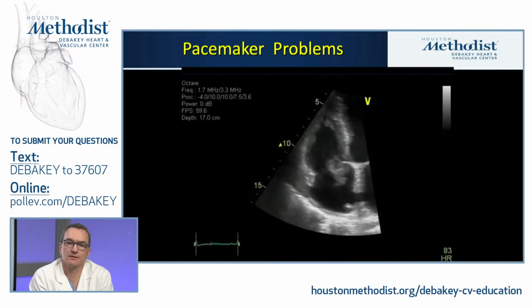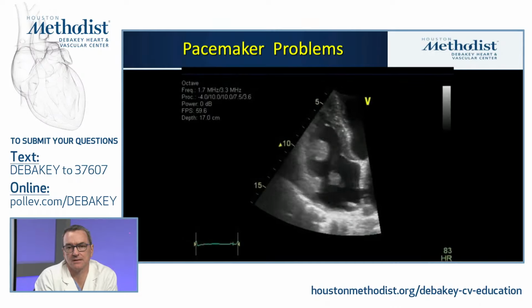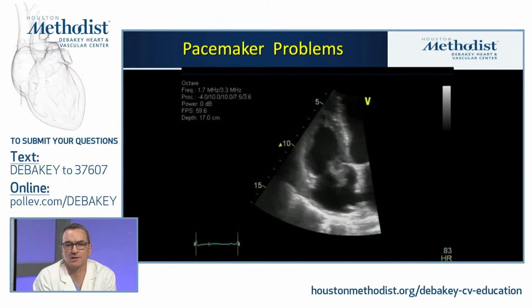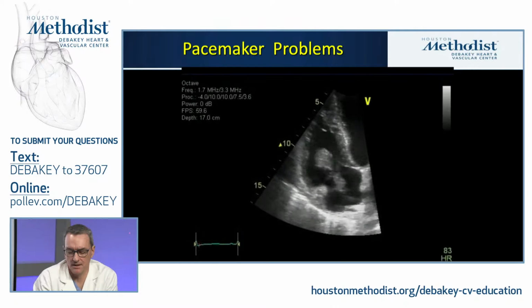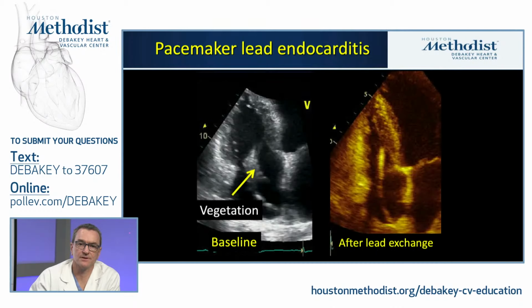This is a pacemaker in the right heart. You can see a bilobed, very large mass. There's some on the lead, perhaps some attributable to the attachment to the tricuspid valve, but generally not. And I say not because when you do a lead extraction, usually that's very effective in cleaning out the visible mass entirely. So after lead exchange, no mass at all, and it was all attached to the lead.